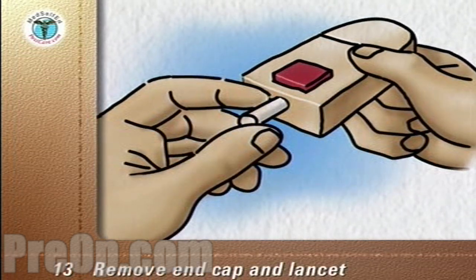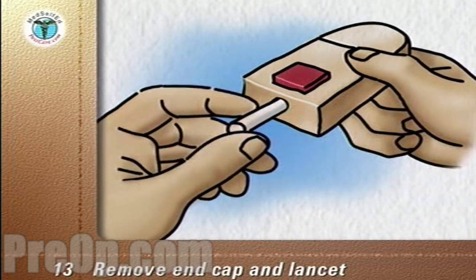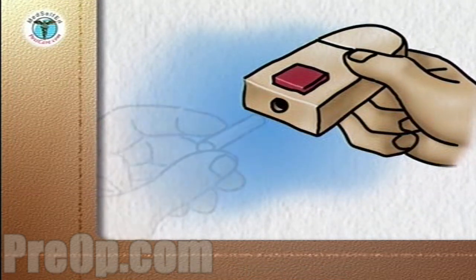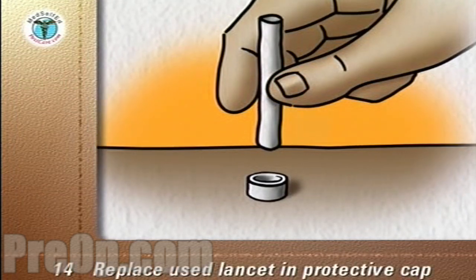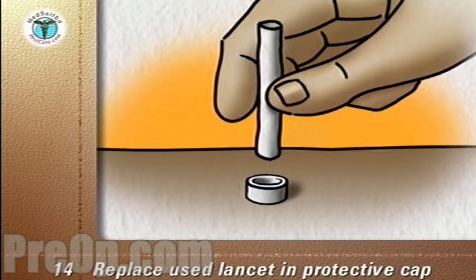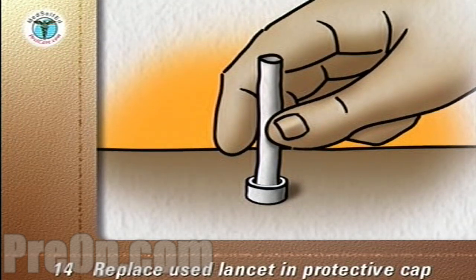Remove the end cap from the lancing device and remove the used lancet. Replace the used lancet back into the protective cap by pushing it into the open end of the cap, which is placed on a firm, flat surface like a countertop.